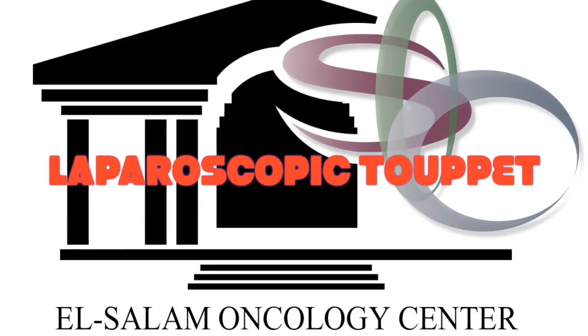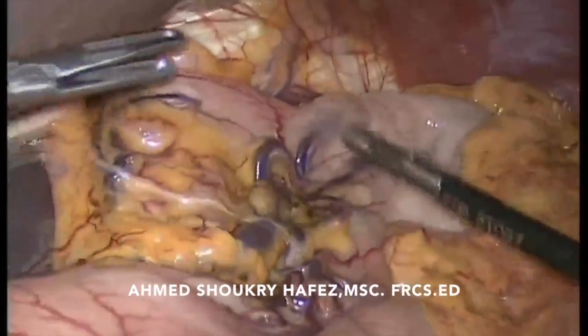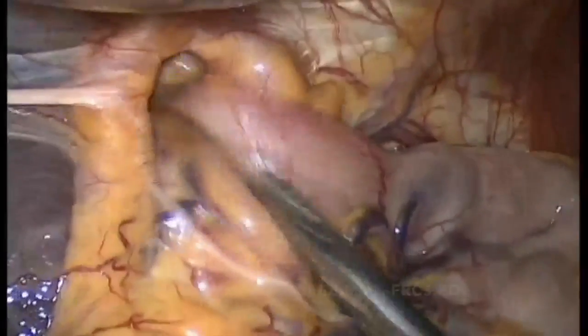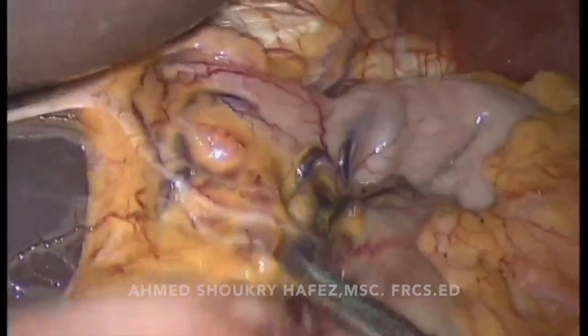This video is concerned with the partial wrap Toupet fundoplication. Toupet fundoplication is a 270 degree wrap, and you see here the hiatal hernia, the hiatal defect, and part of the stomach herniating into the chest.